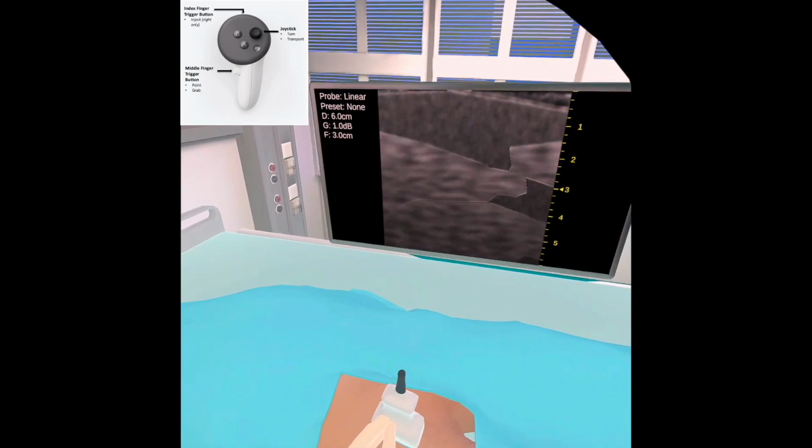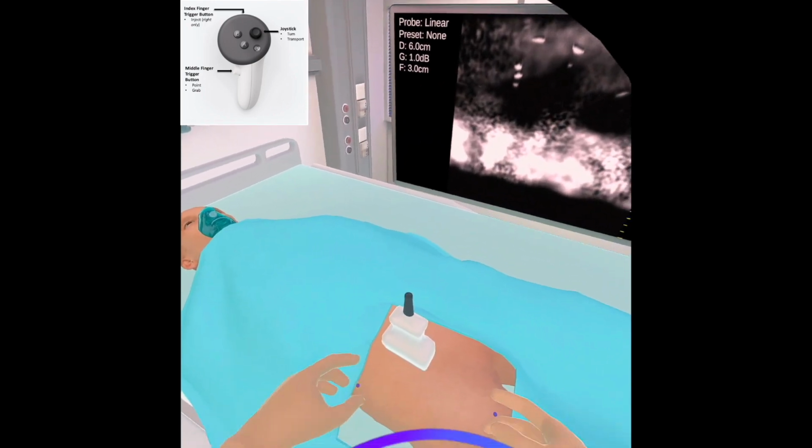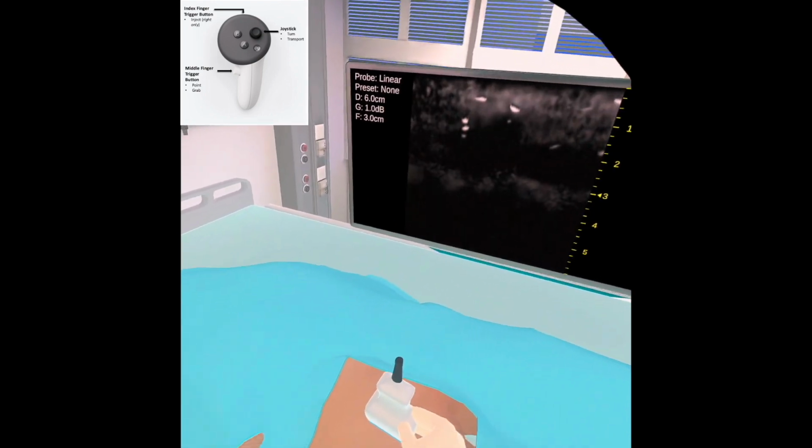This model is specifically focused on the suprainguinal fascia iliaca block, so only the relevant anatomical structures are rendered in detail. As you move outside the target area, the anatomy will become less defined and more obscure.